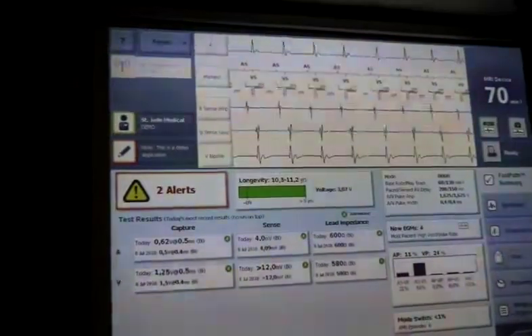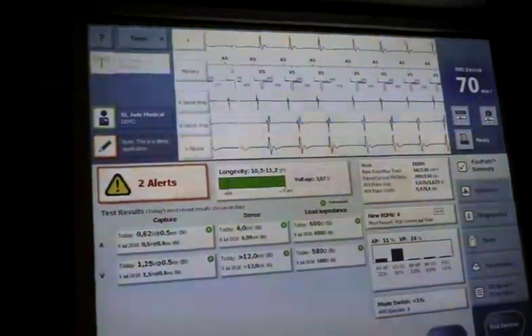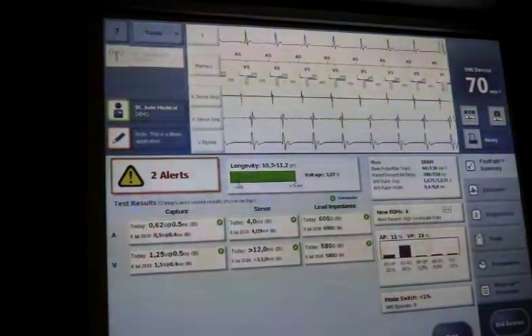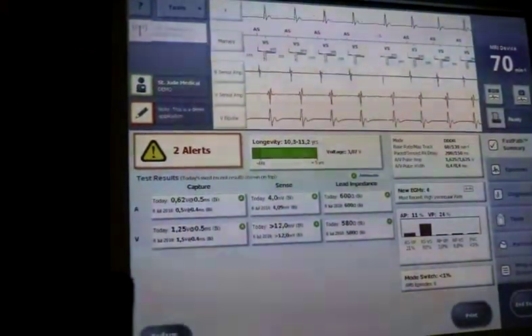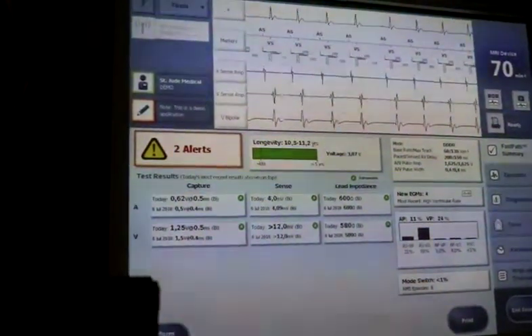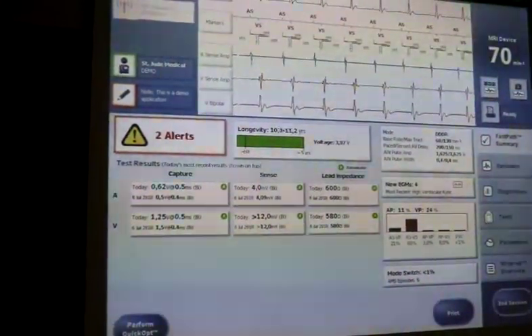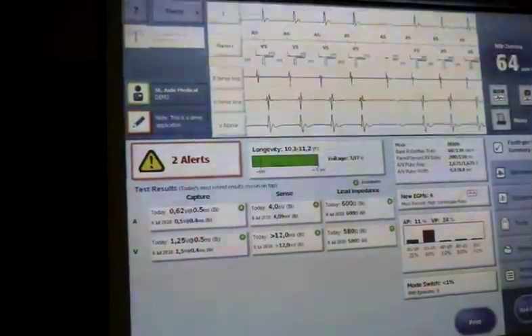They have normal sinus node function from what we can see, and they are a 65-year-old female with reasonably normal cardiac function, okay? So that's not an atypical pacemaker patient, would we agree? 65-year-old female, normal sinus node, intermittent AV block with some syncope.